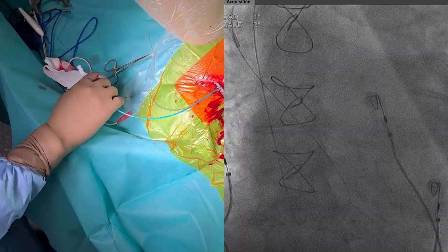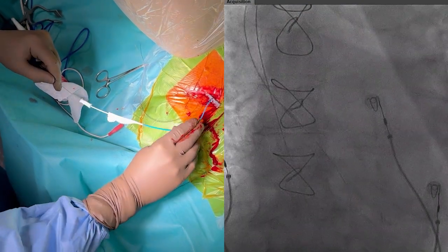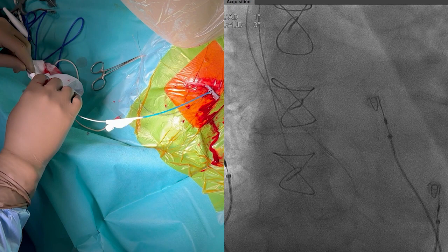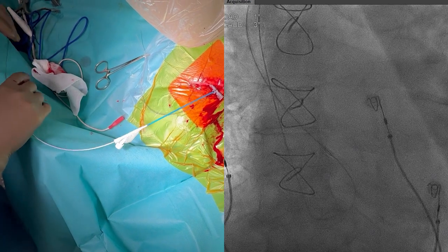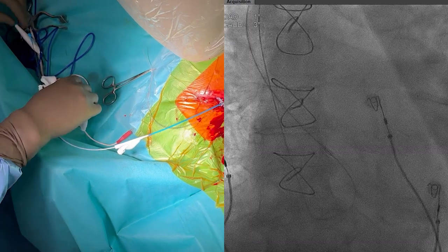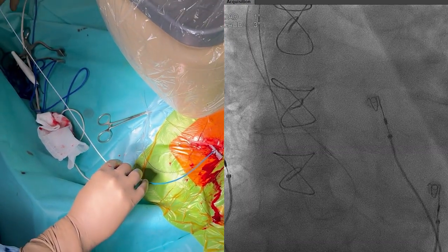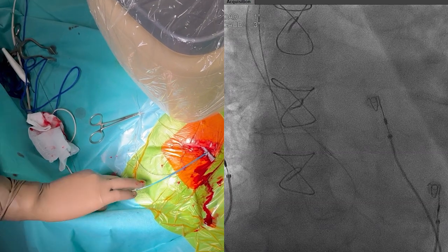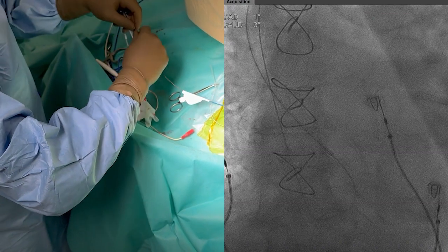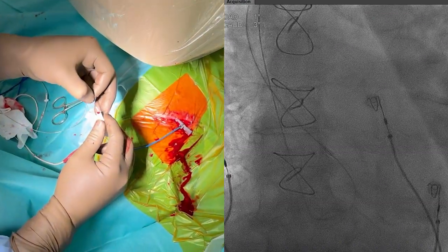The guiding catheter can be introduced into the heart together with the dilator and the guide wire. In some cases the guide wire can be kept in place to gain access to the RV when it was difficult to pass the tricuspid valve, but in most cases this is not necessary. The dilator and guide wire can now be removed to allow insertion of the pacing lead.